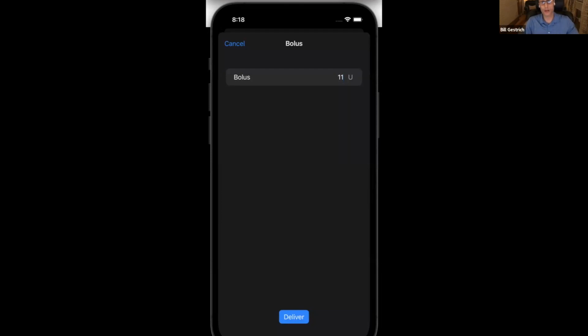Now, I will mention bolus recommendations because you may have seen these before in Loop and in Nightscout. So when you are in Loop and you input, say, 50 carbs and you don't deliver any type of bolus, often later on you're going to see a recommendation that says Loop recommends a bolus of so many units. And then you can choose to accept that within Loop. For a long time, this isn't a new thing. That information gets uploaded to Nightscout. And you may have noticed when you're in Nightscout, it'll show that there's a Loop bolus recommendation.